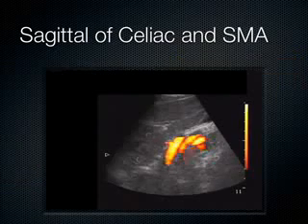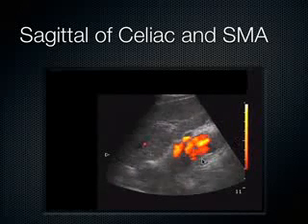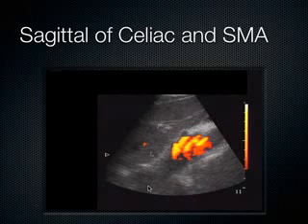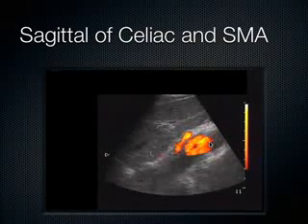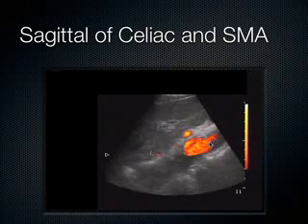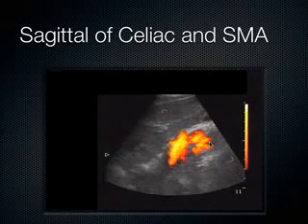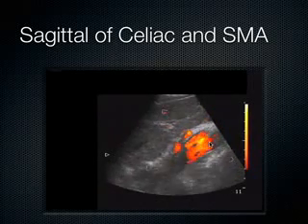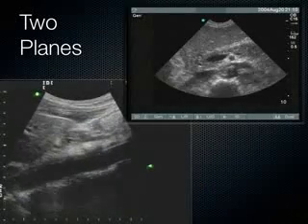And on ultrasound, this is an example of a sagittal view with the aorta running along here. And we can make out with the color, this is that first branch, celiac, second branch, SMA, and this is just some flow left in the aorta where this happens to be picking it up. So just to show you that while you don't need color flow really for much here, with the aorta, it just helps to outline and give the aorta a little bit of definition for you.